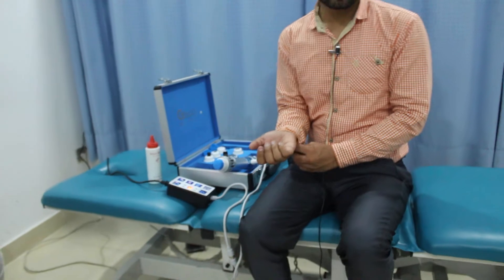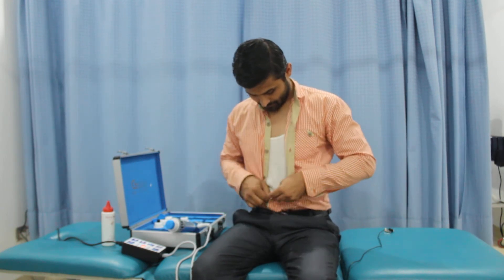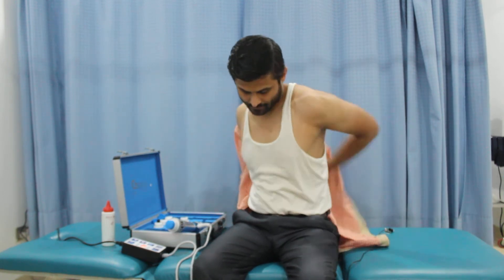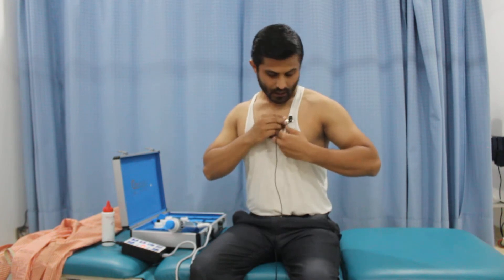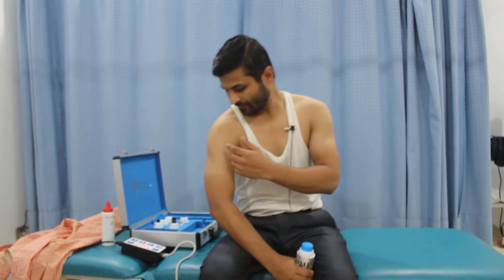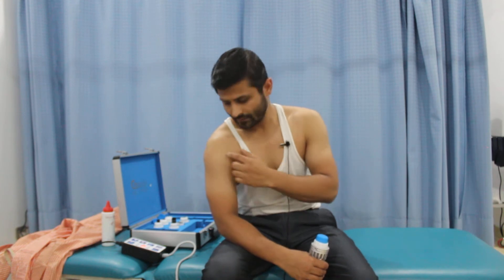I have to choose the most appropriate area to apply. For example, if I have to apply it on my shoulder, I need to expose the shoulder — for this video I'm showing you the complete procedure. If I have calcific tendinitis of the deltoid middle fibers, it's usually the supraspinatus or the bicep. Whatever the region is, you need to identify it first.